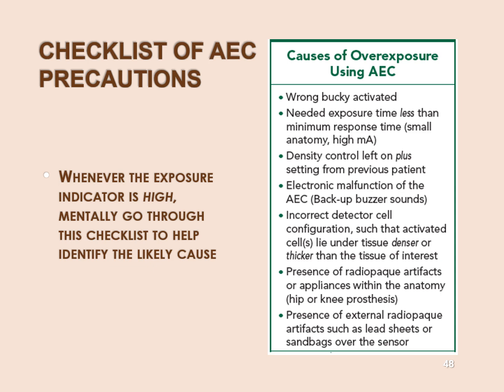So ask, have you ever had your hip replaced? If the answer is yes, don't do the AEC, do a manual technique. Now, what's your manual technique? You've forgotten it because you do AEC center cells on all your hips. For a digital age DR plate, I'm going to say 85 at 10 mAs is going to get it for your sthenic habitus.